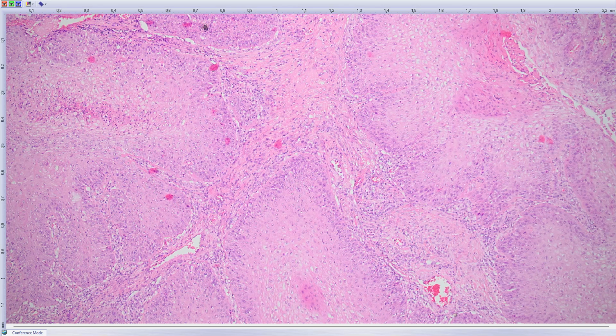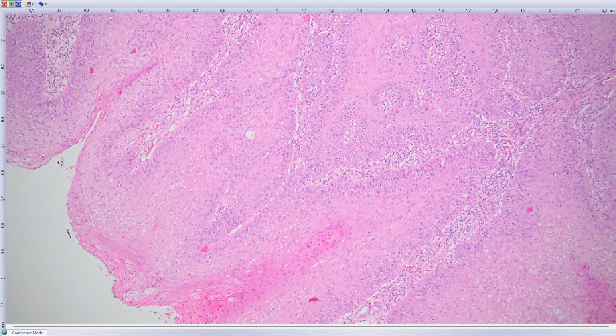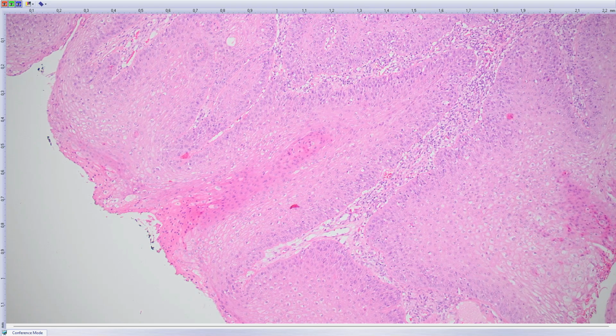And before that, it's a funny story. The lesion was frequently biopsied, and they didn't know it's carcinoma. They reported it as papillomatosis, acanthosis, hyperkeratosis, whatever. And eventually the clinician, an otorhinolaryngologist, went to Ackerman's office and showed him pictures from the actual patient, and asked him what kind of keratosis this is.